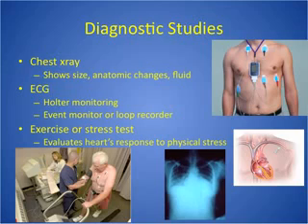Now, a Holter monitor and event monitors are a type of ECG monitoring. So a Holter monitor, and that's just an example of one in the upper right corner, is a continuous ambulatory ECG, and it gives us diagnostic info over a period of time. An ECG tells us what's happening right now at this very moment. But a Holter can tell us what's happening over the course of 24, 48 hours. It's not invasive. The most they have are the little stickies on their chest, so typically when they go home with this, they can't bathe for 24 hours.